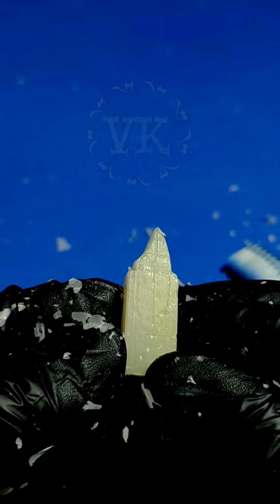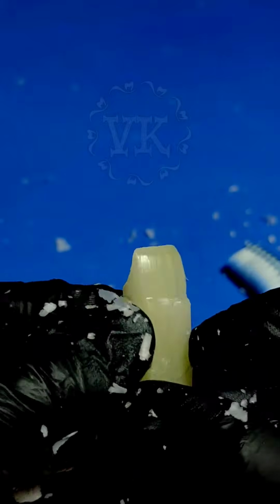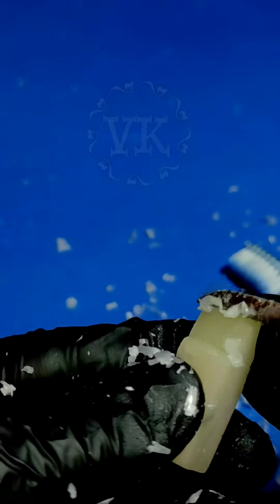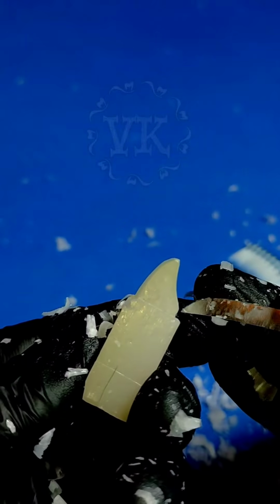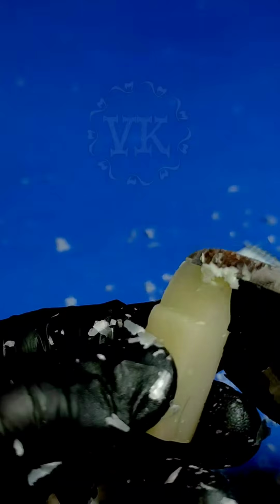Now I think the margin is perfectly closed in. Just the palatal side seems to have a little bit more wax, but I prefer to reduce from the labial side because the labial side is flatter. If you reduce from the palatal side, sometimes you lose the prominence of the cingulum and that will make the tooth look unnatural. You need to have the cingulum a bit prominent for the central incisor. For the lateral incisor, the cingulum is a little bit less prominent, but for the central incisor, the cingulum is a bit more prominent.